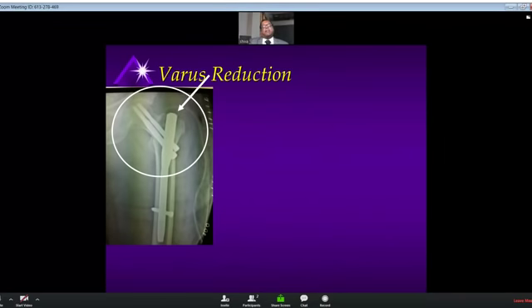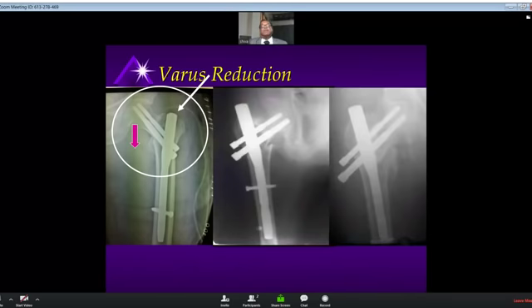The reason is the nail has been inserted from the fracture side without making space for the nail. So you can see the widening of the entry site, and because of this varus, instead of the head and neck sliding along the screw towards the nail and compacting the fracture, the direct varus forces are more, and that leads to superior cutout of the screw or backing out of the screw.